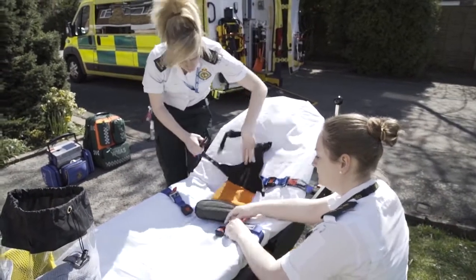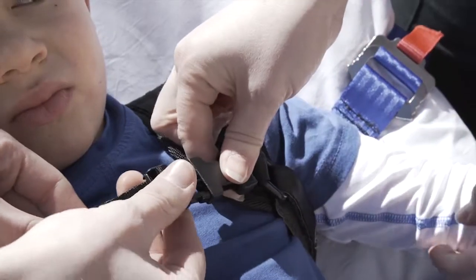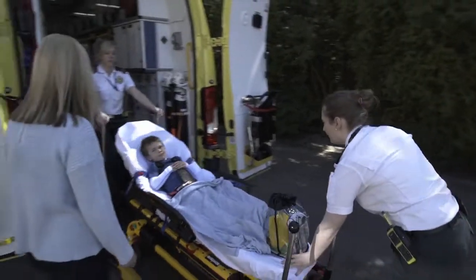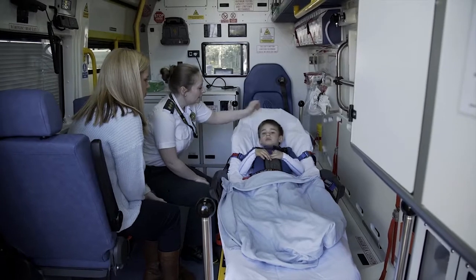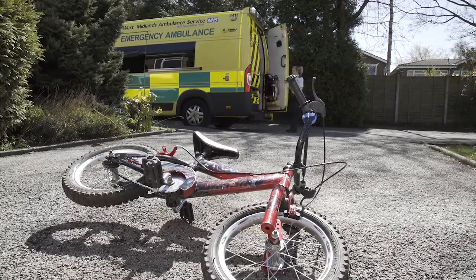The ACR is really easy to operate — we keep it in the back of the ambulance, it comes out in a little bag, and it's quick to use. There are massive advantages: because it comes in three or four different sizes it means you can safely secure different sizes of child to the ambulance cot. It doesn't create any pressure to the child's chest, and clinically we have full access to the child without releasing them from the restraint itself.